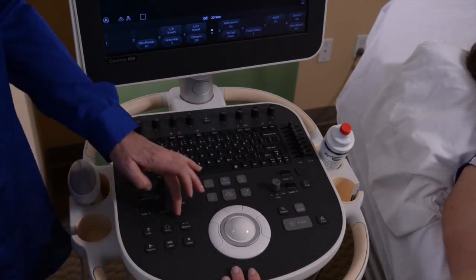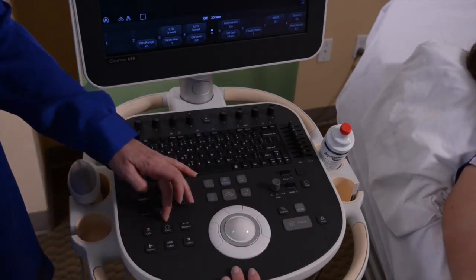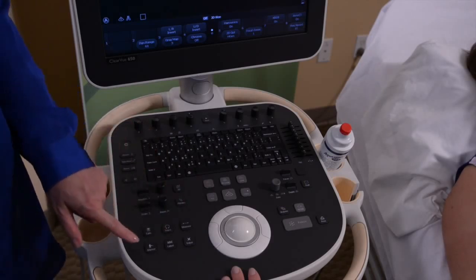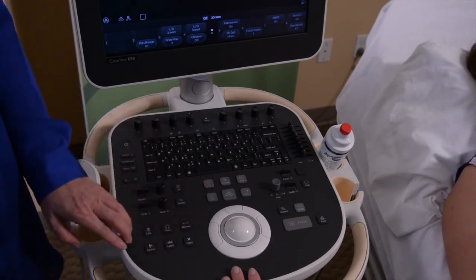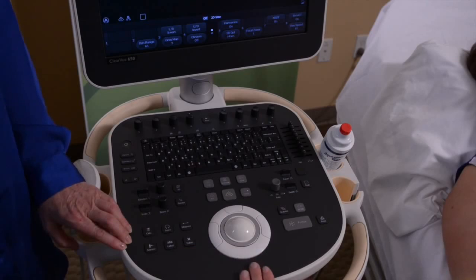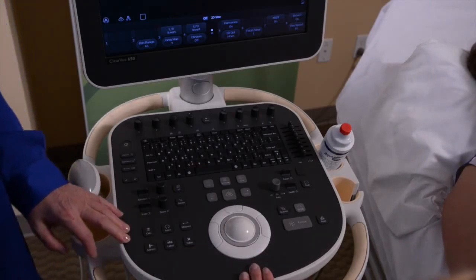These are where you would do your measurements, turn on your calculations, do any kind of annotations, body markers. All of this is grouped here on this side for you — more labeling and measuring.